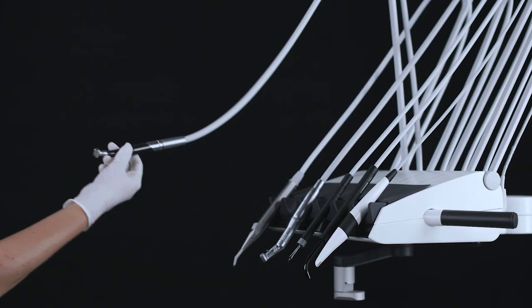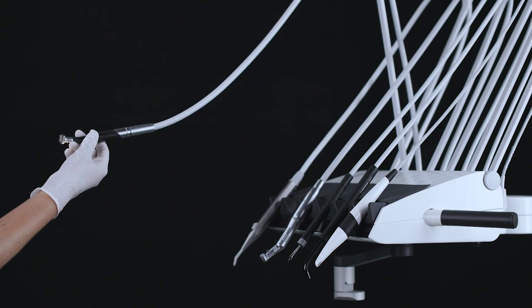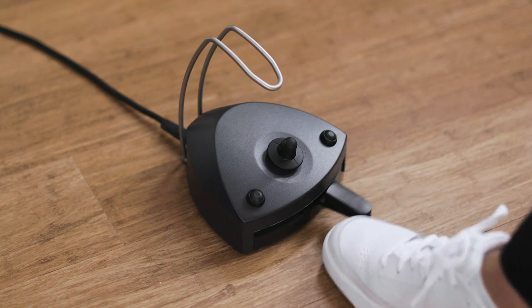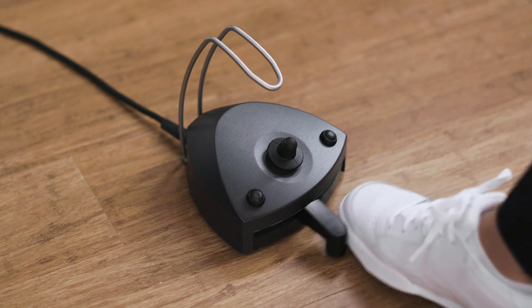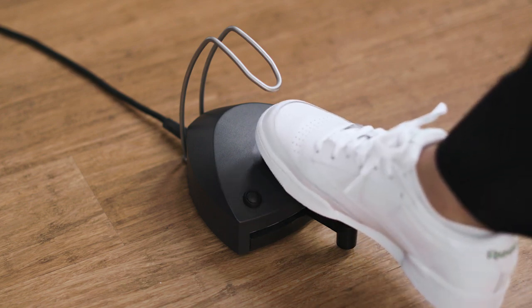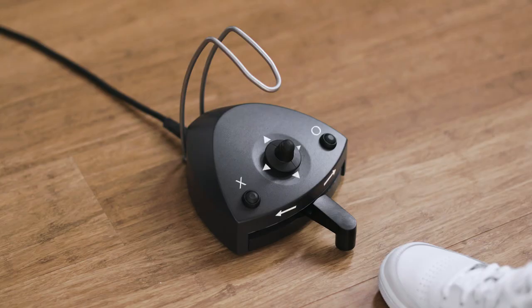Lift the air instrument forward and control it with the foot control. Activate the air instrument by moving the pedal right or left. You can see the drive air on the display, shown in percentage of maximum. The drive air will increase when you move the joystick north.